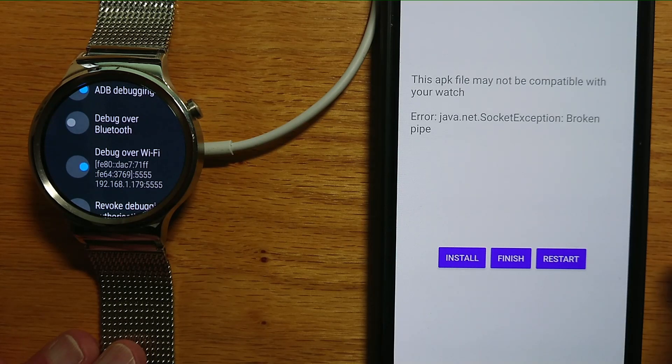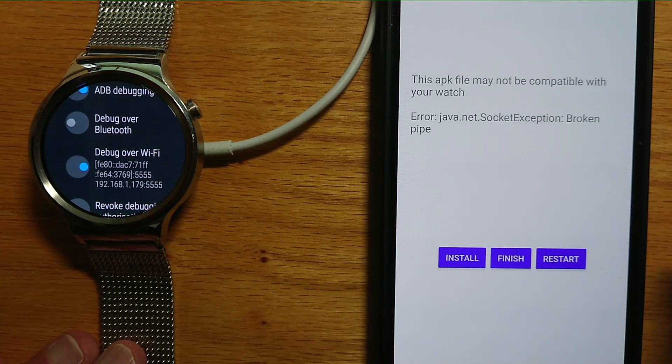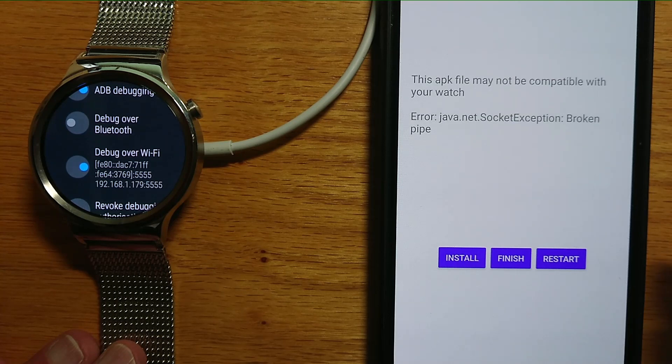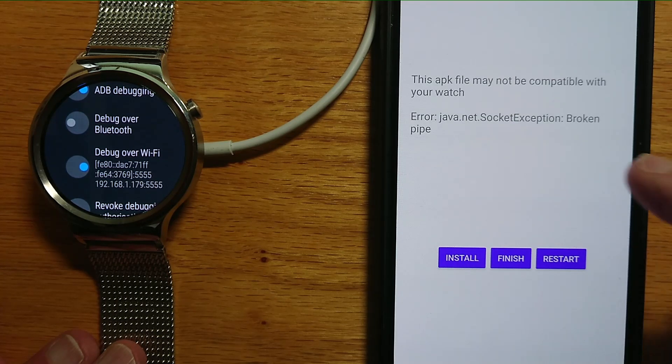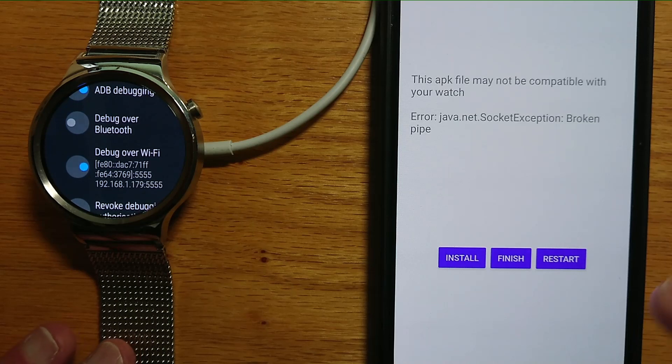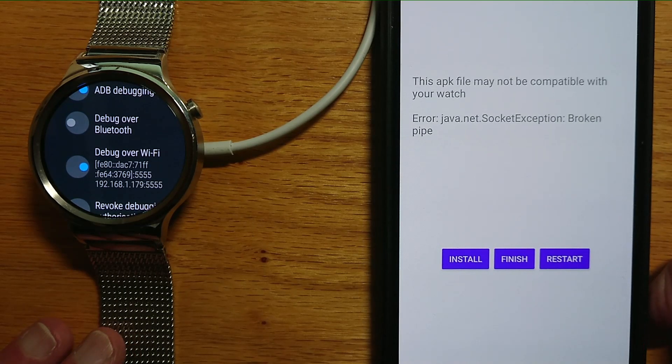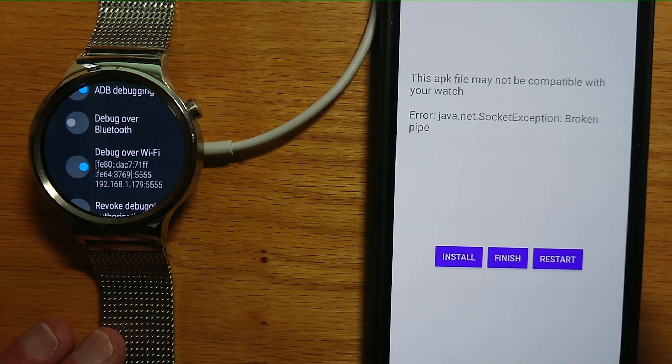Now unfortunately, this watch is running a version of Wear OS that's too old for WearInstaller, and it's giving me a message saying broken pipe. So we're going to use another method to install the watch face.